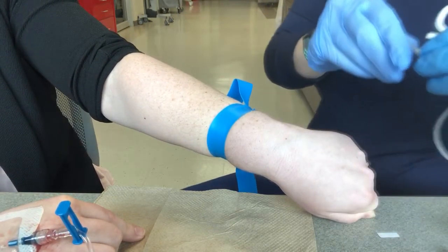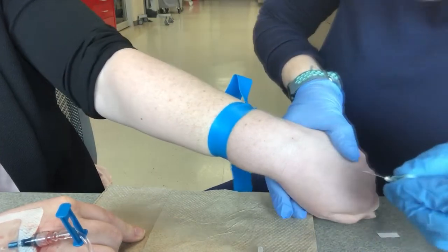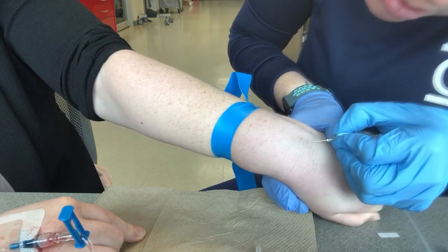You still want to pull everything taut, like that. Just want to make sure your bevel is up — it's the same thing as when you're starting an IV.